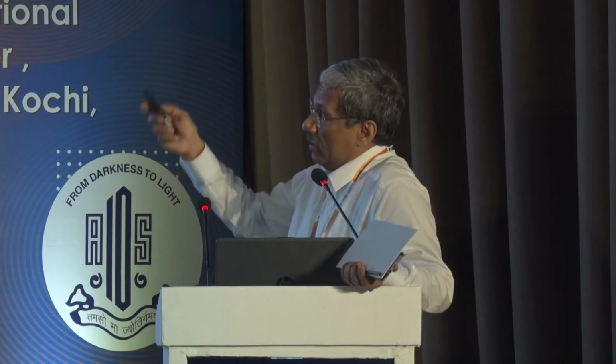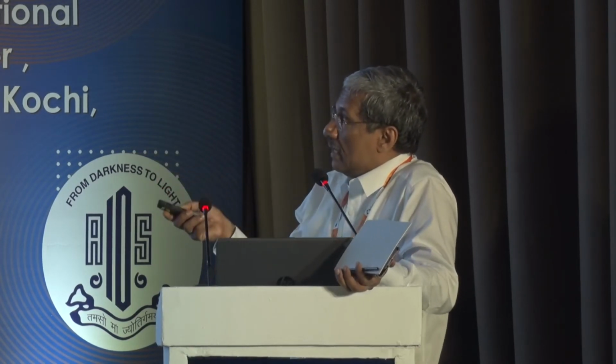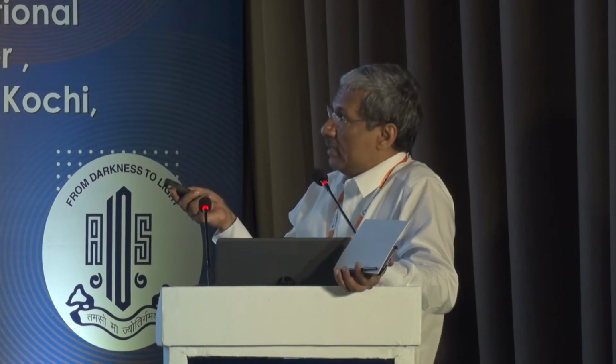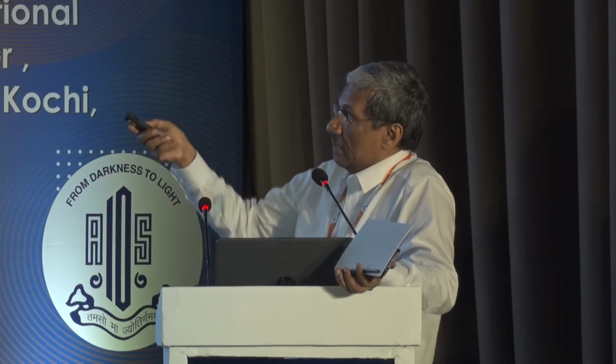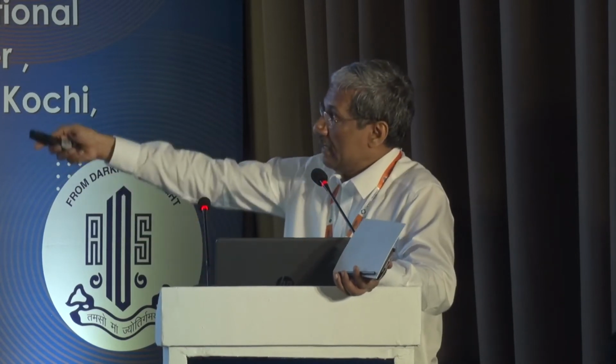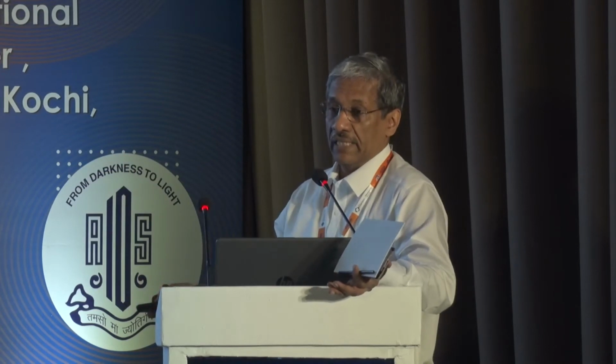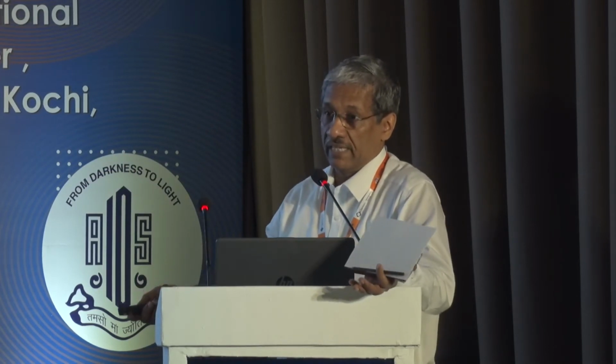So all these slides are based off a study done by Douglas Koch, Li Wang, and his co-workers, and they took 150 patients and compared a standard Scheimpflug tomographer with the central topo. The three researchers, who are all good with corneal work, compared the two and decided what kind of decision they'd make on these eyes.